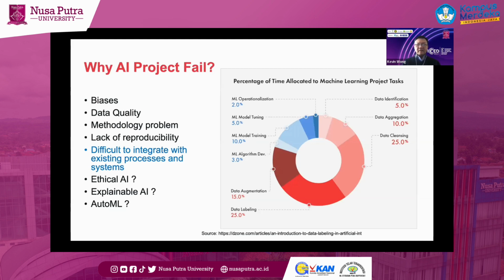As you can see just now, right? The data given to you from one hospital might have a bias to the condition of the first hospital. But when you move to the second hospital site, you need to do some adjustment, whether you do histogram equalization or some other pre-processing, or you have to use transfer learning and see how you can enhance your model. And of course, data quality is one of the important issues why projects fail, right? And of course, the first two are very important.